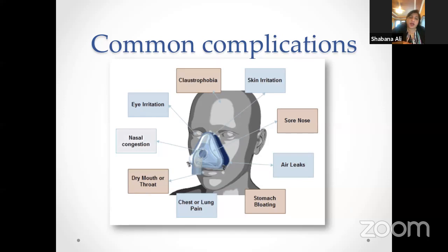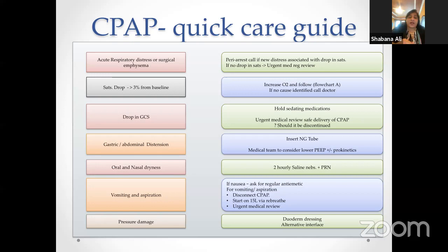And of course, dry mouth and throat because of the oxygenation, we already covered that. Nasal congestion and eye irritation. You can see how the mask is fit right by the eyes, and it may cause irritation because all the pressure is coming out of the mask to the eye area. So this is a good guideline about how to quickly care for a patient who is on CPAP.